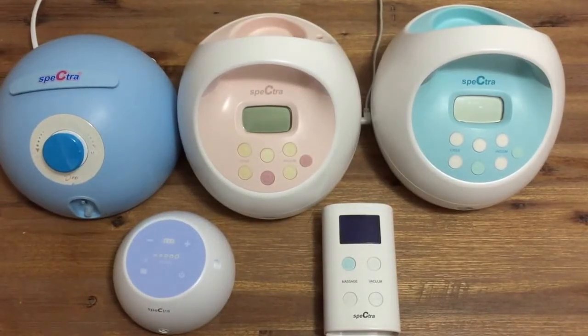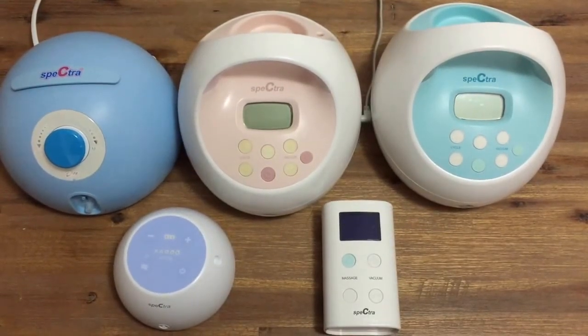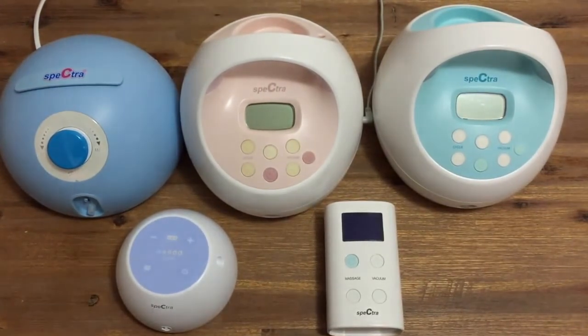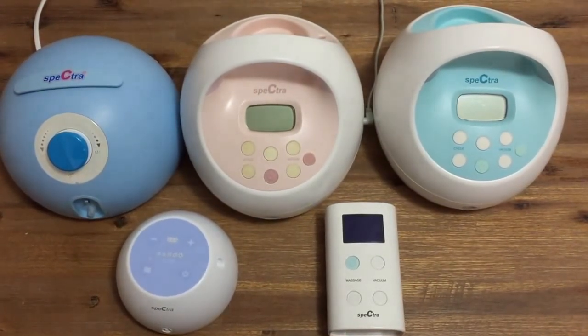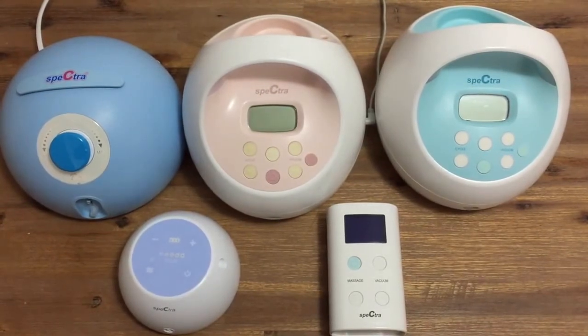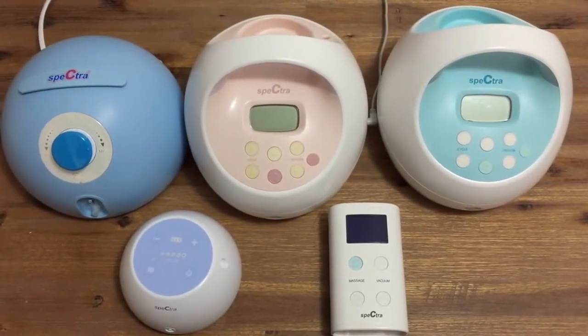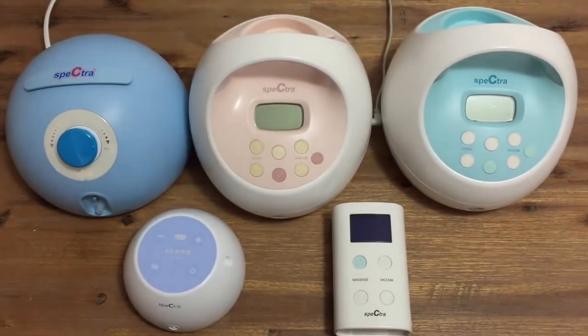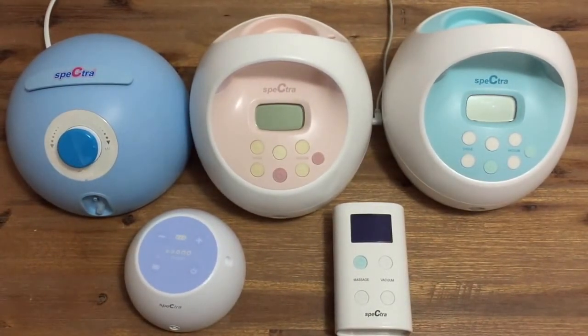Hi and welcome to Spectra Baby Australia. My name is Clay and today I'm going to compare our full range of breast pumps for you. It can be really confusing working out which pump is right for you, so during this video I will run through the key functions of each pump, explain the recommended use, and demonstrate each of our five pumps in use for you.